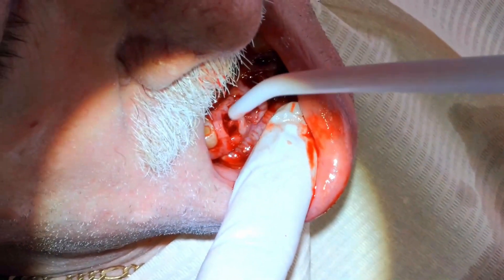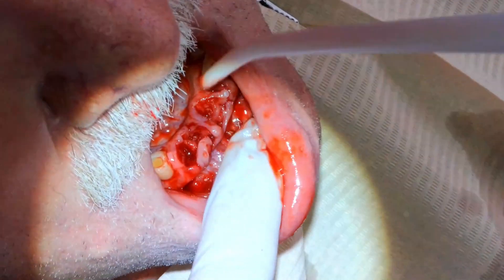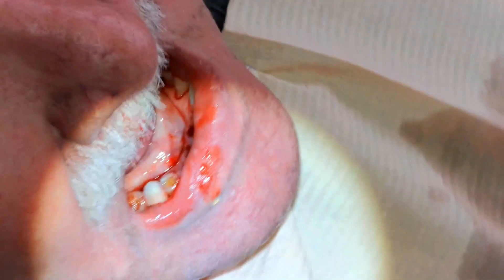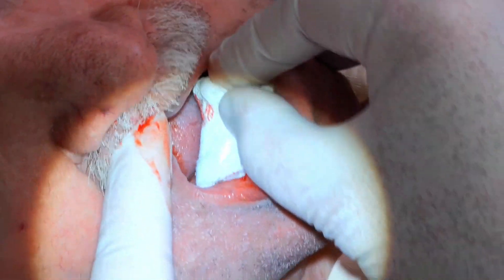Just going to have the patient bite down on some gauze. I spoke to him the day after and he said the bleeding has stopped and he's feeling great. So I'm going to do a follow-up video in a week or so to see how he's healing. There's the rolled up gauze — put it down, have them bite down, leave the pressure on it.